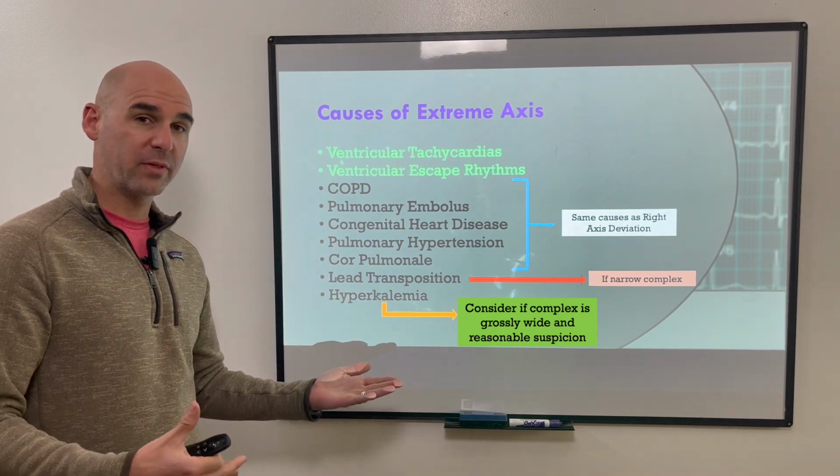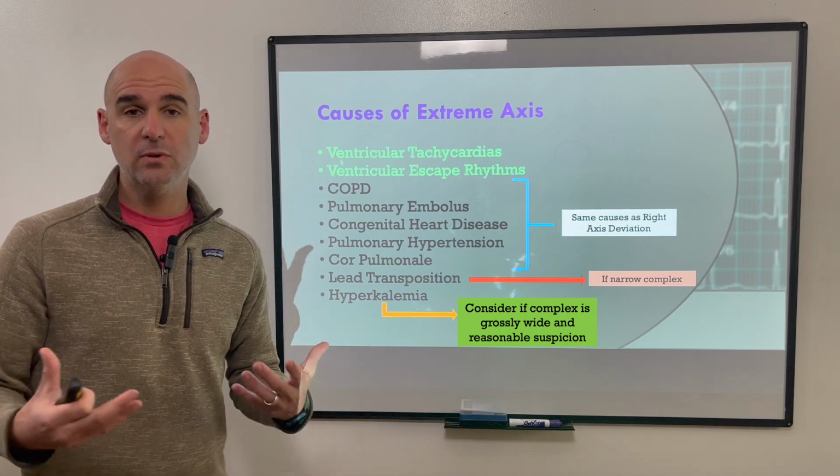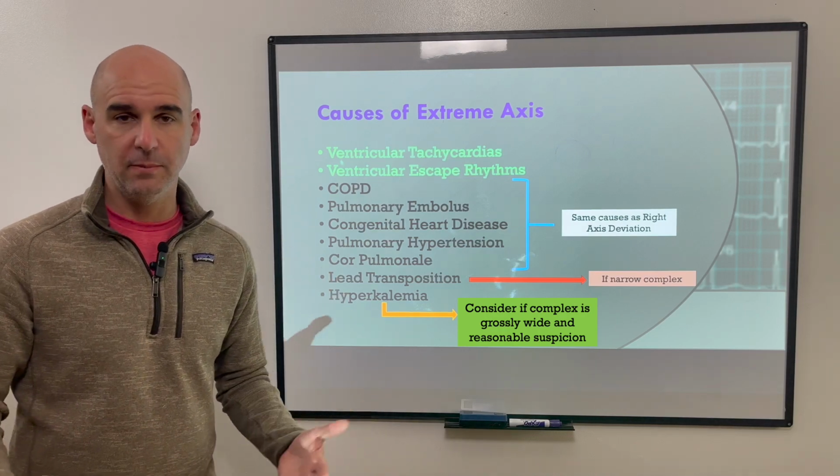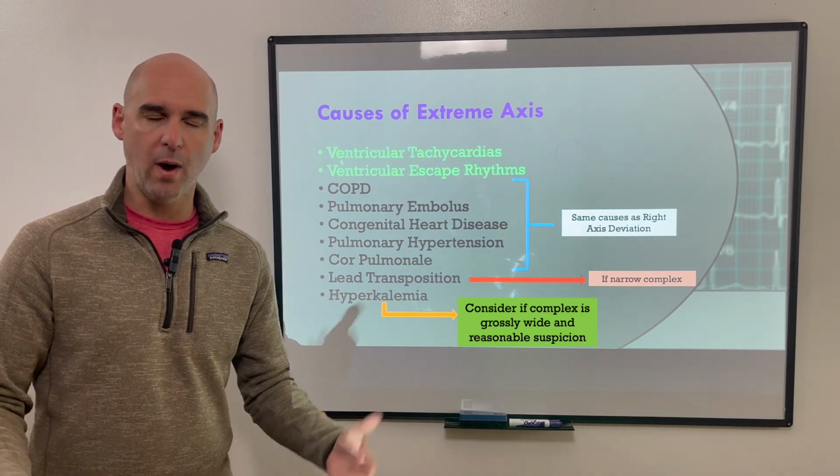And then the other part with hyperkalemia that we suspect is there's got to be a reason, right? People don't just automatically develop hyperkalemia. So is there a reason for suspicion, and is this grossly wide?